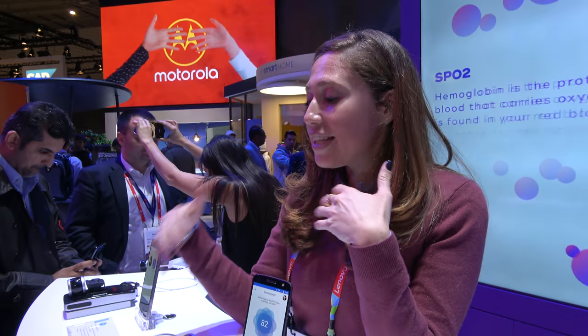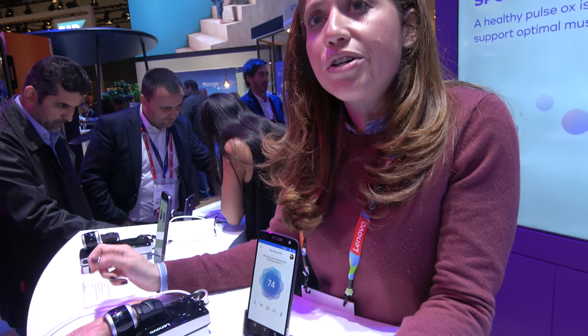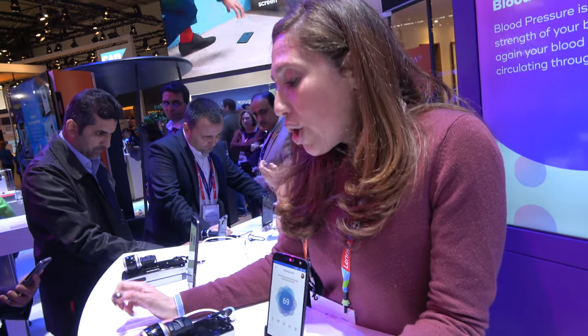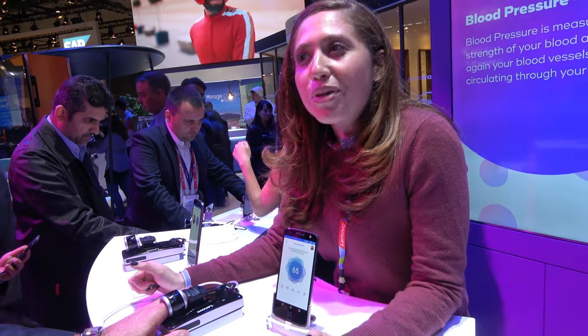How does it compare with doing it on the arm? This is novel technology to Vital — this blood pressure measurement. Is it FDA approved? Not yet. We're in the process of going through our clinical trials with Harvard, actually. How soon will it be FDA approved for all these functions? I don't deal with regulation, but we should be filing in the near future.